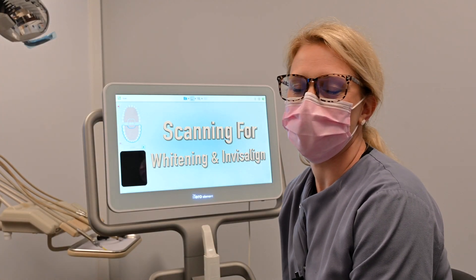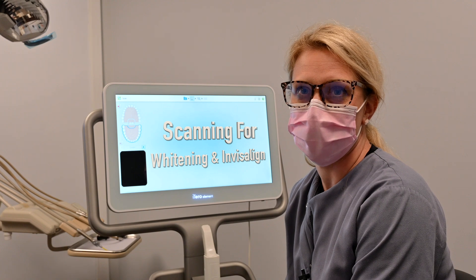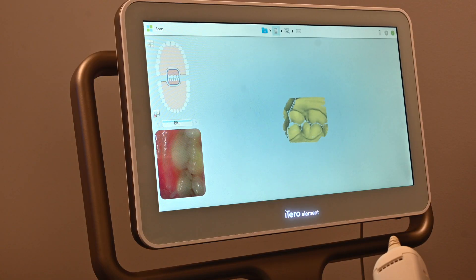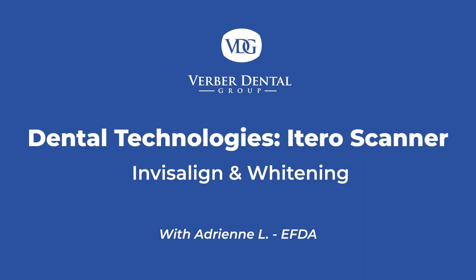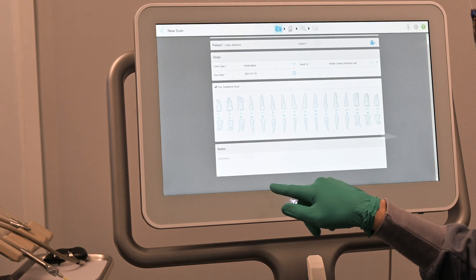My name is Adrienne. I work at Burber Family Dentistry. We have a patient interested in Invisalign, so we are going to show you how to use the iTero for an Invisalign scan. I'm going to load you up into this prescription.